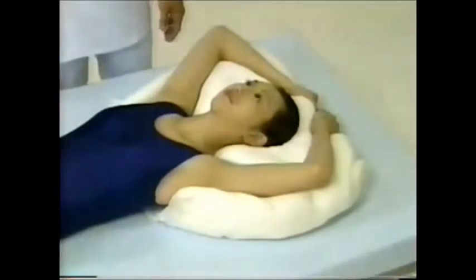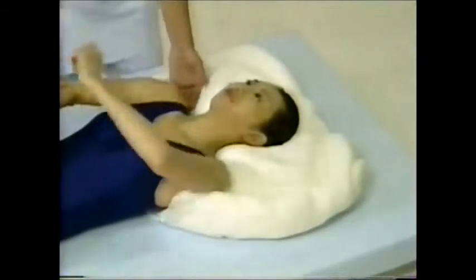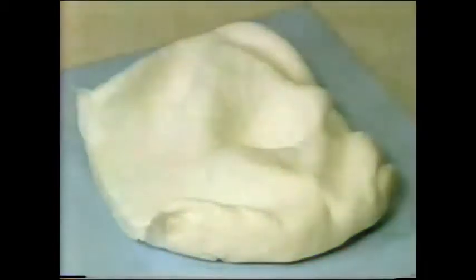When MoldCare RI-2 starts to harden, slowly remove the patient taking care not to alter the shape of the device. At this stage of the production process, MoldCare RI-2 has not sufficiently set. The user should take care not to apply any additional pressure which could change or distort the shape of the device. After removing MoldCare RI-2 from the patient, the process is completed by allowing the device to set at room temperature for 10 minutes. The mold will accurately reproduce the treatment posture of the patient.